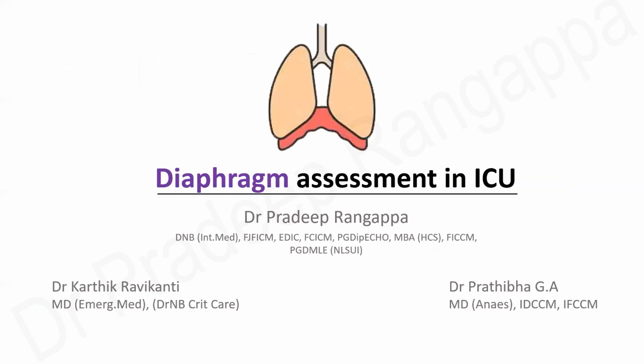Hello, friends. So today I'll be giving a brief overview on the diaphragmatic assessment in ICU. At the outset, I wish to acknowledge my colleagues, Dr. Pratibha and Dr. Karthik Ravikanti, who have helped me to develop this content by giving images within our ICU.